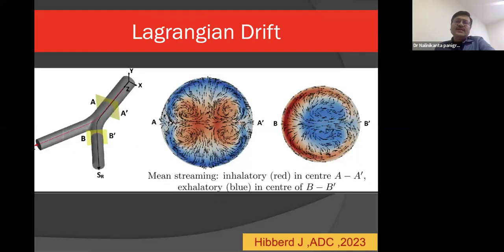To understand that, we can see this picture. This happens in parallel. This is a new principle, new theories in comparison to the previous theory. This is a Lagrangian drift. Whenever a fluid movement happens, this newer concept they are applying, they're saying inspiration over expiration comes, it is not like in conventional ventilation.